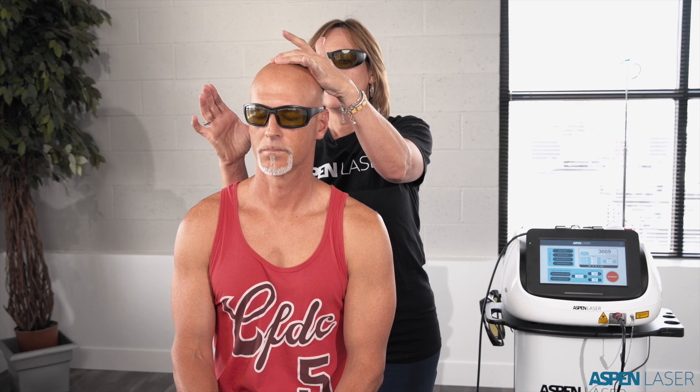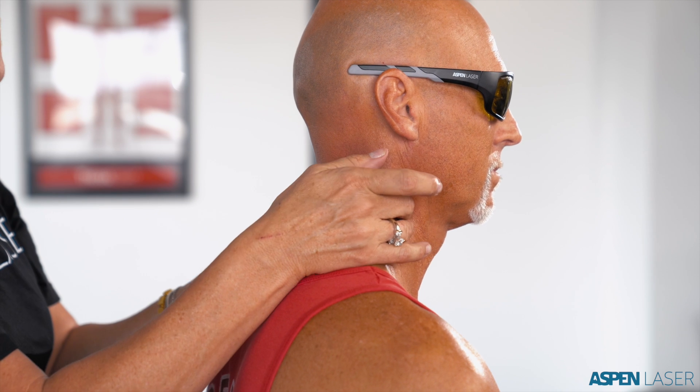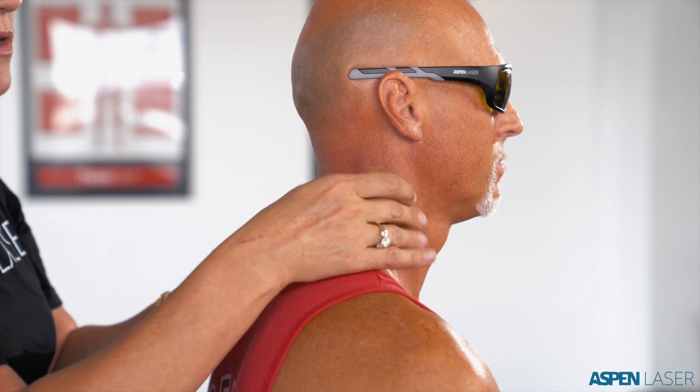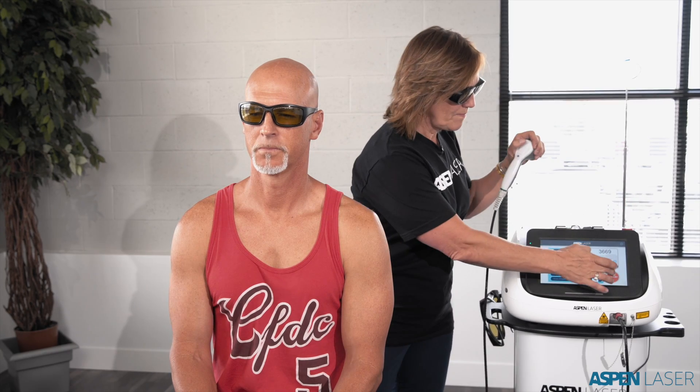We're technically finished with this protocol, so I'll disarm my laser, return the handpiece, and start palpating. Our treatment windows are 15-minute windows. Oftentimes people don't feel pain at rest or with motion, but I can palpate common areas that contribute to overall pain — such as the base of the skull. Any discomfort there? A little bit — about a four on the scale. And another area is the front of the neck, called the sternocleidomastoid muscle. Pressure there — what's the pain? Four. I can also palpate the trap areas for more discomfort. So now I've identified two more areas and I'll rearm my laser.